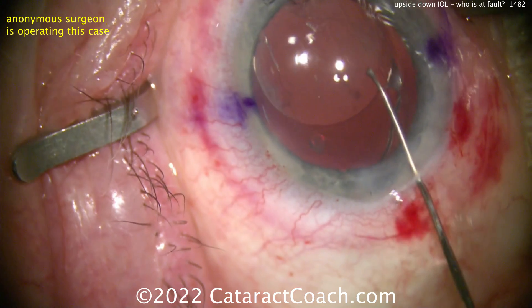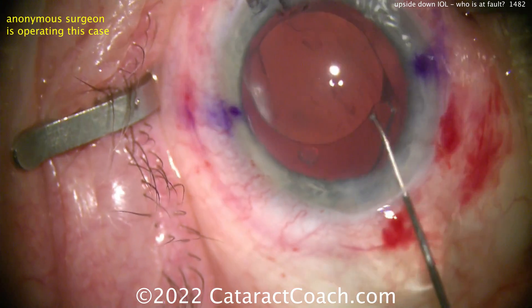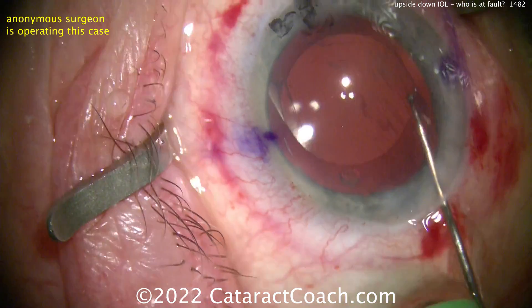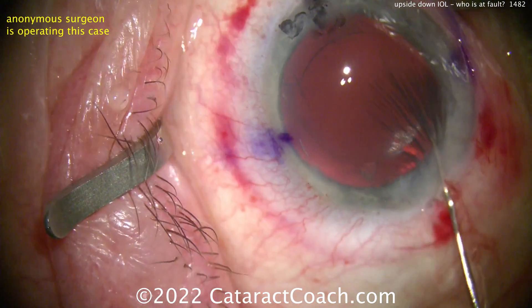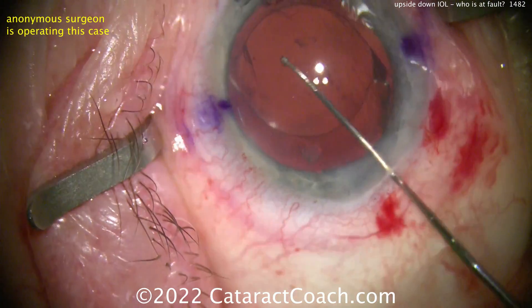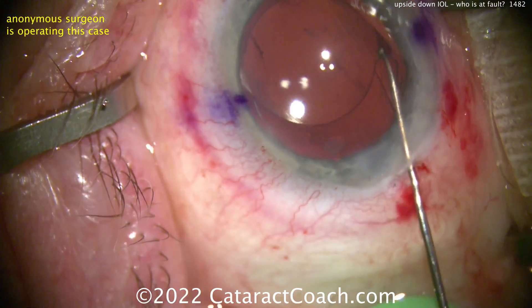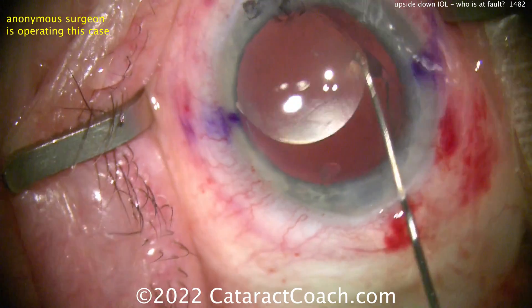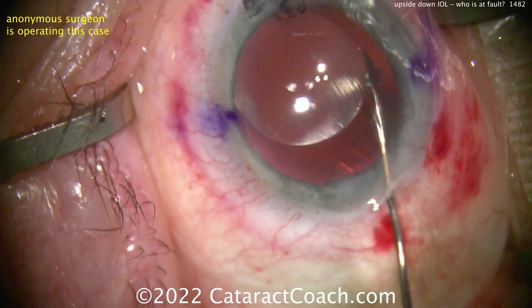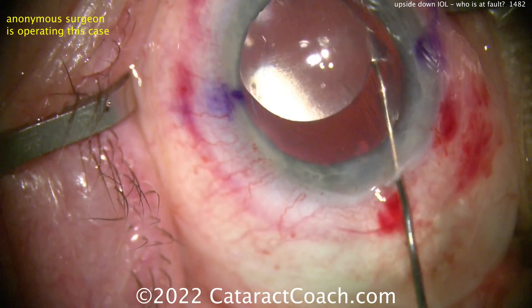What are you going to do? You can flip the lens — and in the second video I'll show you, the surgeon does flip it. But in this case the surgeon just plays around a little bit, kind of in denial probably. I've shown you a case where I had a misloaded lens that went into the eye upside down and I was able to flip it back and proceed normally.